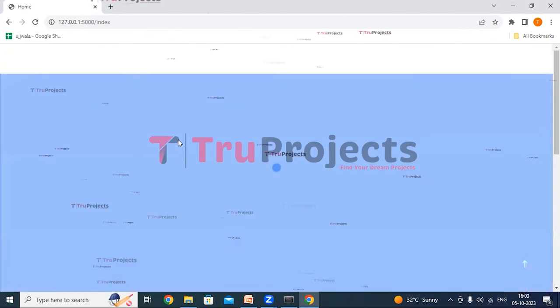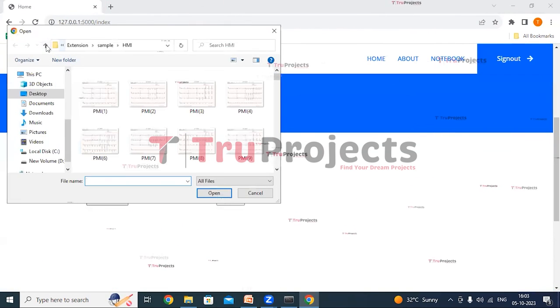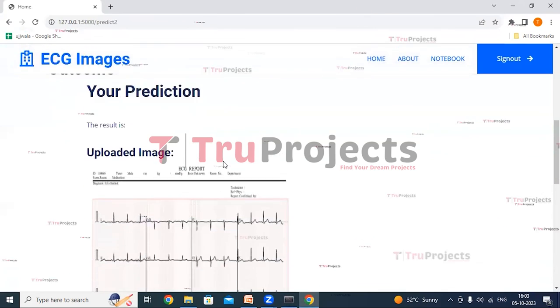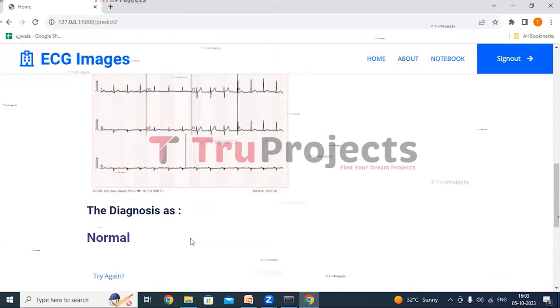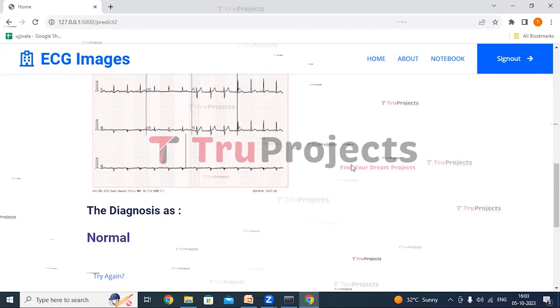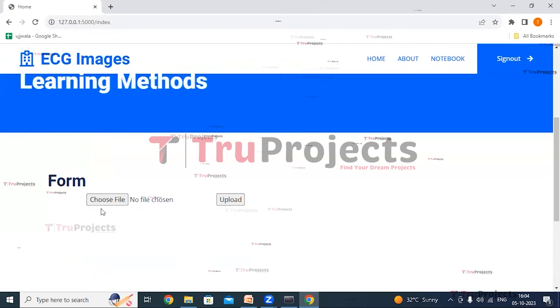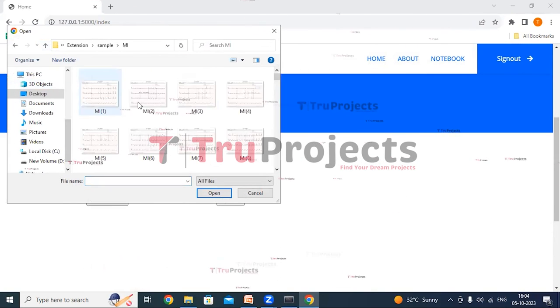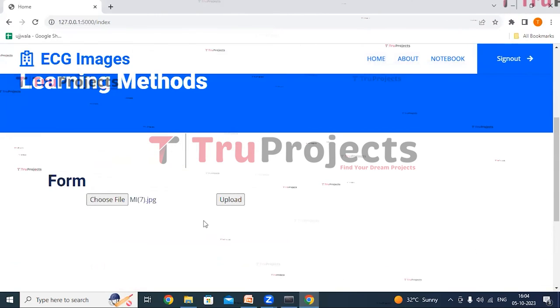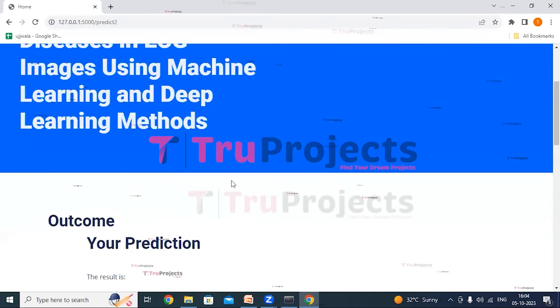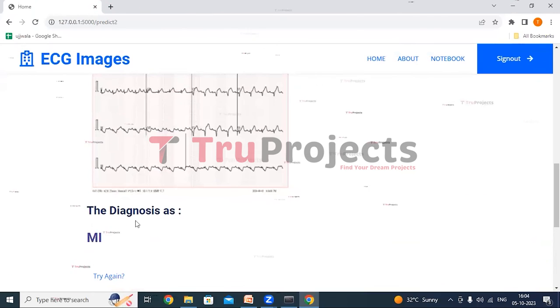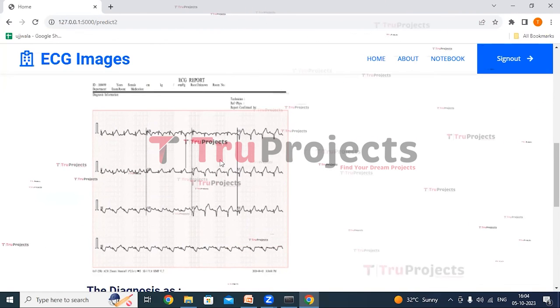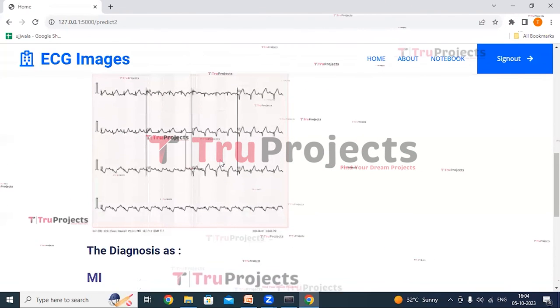Clicking on home again. Clicking on choose file button — we'll try with a normal image. Clicking on upload button. This is the uploaded image and here we can see the diagnosis as normal. Clicking on home again, choosing another file — giving the seventh HMI image and clicking open. Clicking upload button. We can see the diagnosis as MI. Similarly, we can upload any ECG image and get the diagnosis.